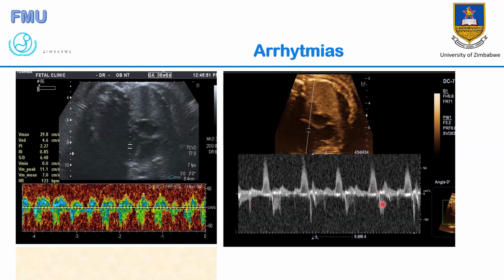Without doing anything, we didn't change the speed here. So if we didn't change the speed, what it means is that this is a very slow heart. It's unfortunate we didn't put the heart rate in here, but this was a very slow heart, beating around 50 something beats per minute. You can see we do not have an atrial contraction following the ventricle. Look where the atrial contraction is actually in front of the ventricles here. So that means there is no sinus rhythm. There is a disconnection between the atria and the ventricles in the manner the heart is contracting.